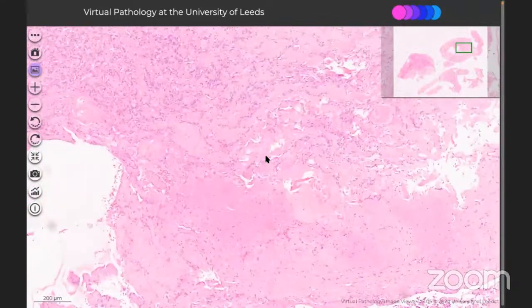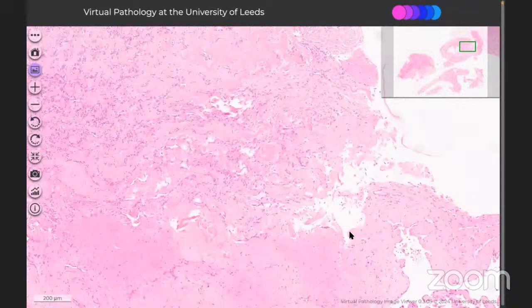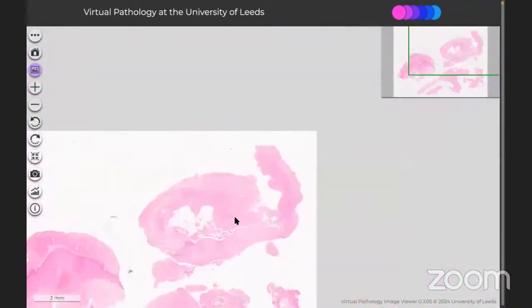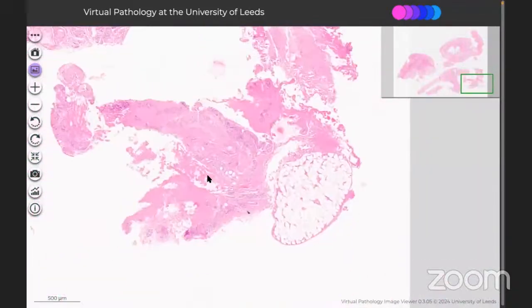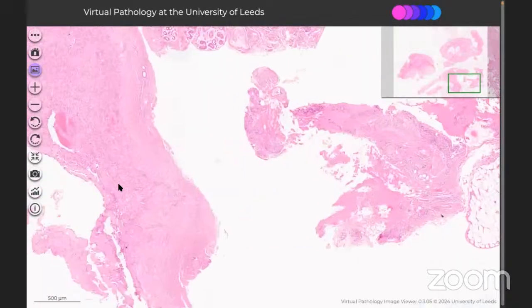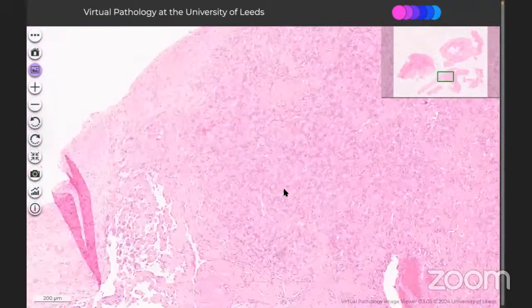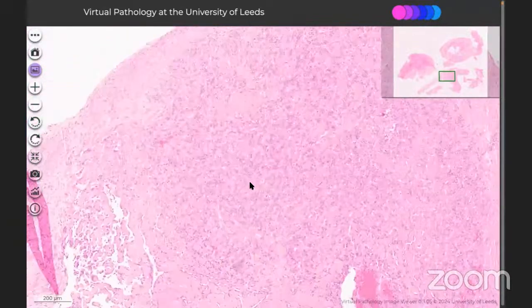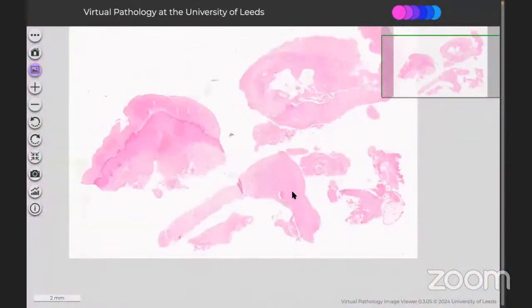So this is a papillary intravascular endothelial hyperplasia, also known as Masson tumor. Okay, so Masson tumor is a benign lesion. Some are detected mostly at the site of trauma and in the process of recanalizing the thrombosed blood vessels. Okay, so the etiology is mainly trauma induced thrombus.